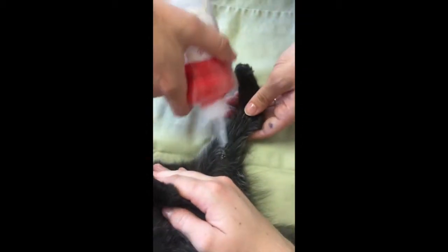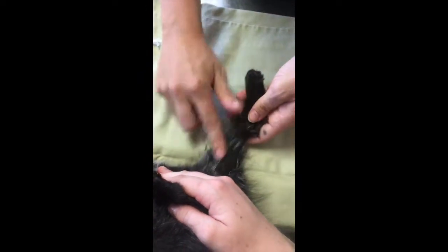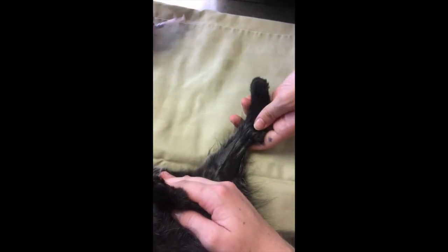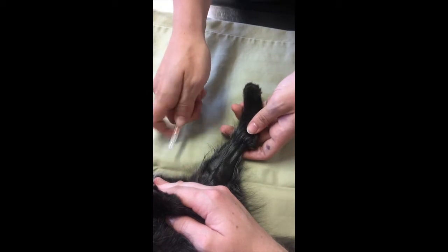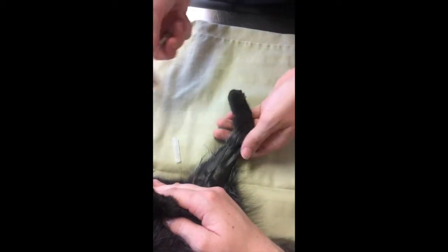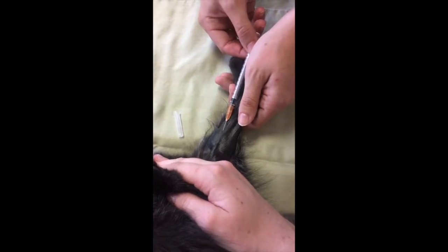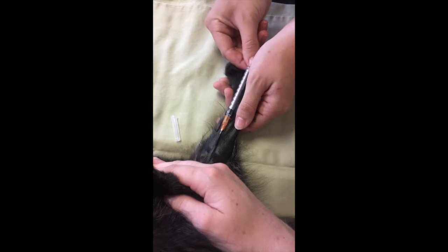Alright, so I'm going to go ahead and put some alcohol. So you can see the vein running right here, so I'm going to go ahead and take my syringe, my needle, cap off, make sure bevel side is up, and insert the needle, pulling back on the plunger.